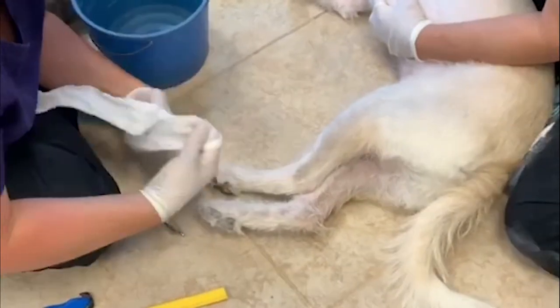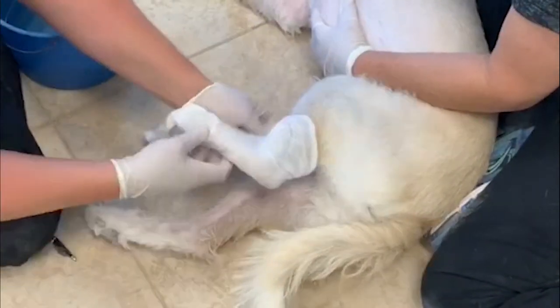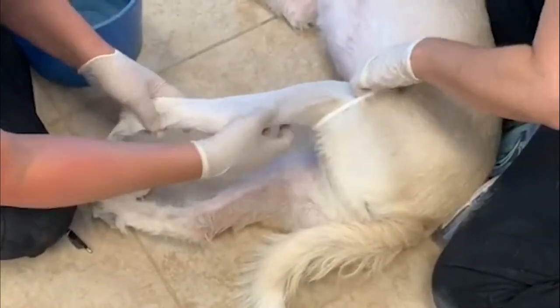First thing you want to do is put your nylon on. It protects the hair and the skin. Then have your assistant help you hold the nylon.